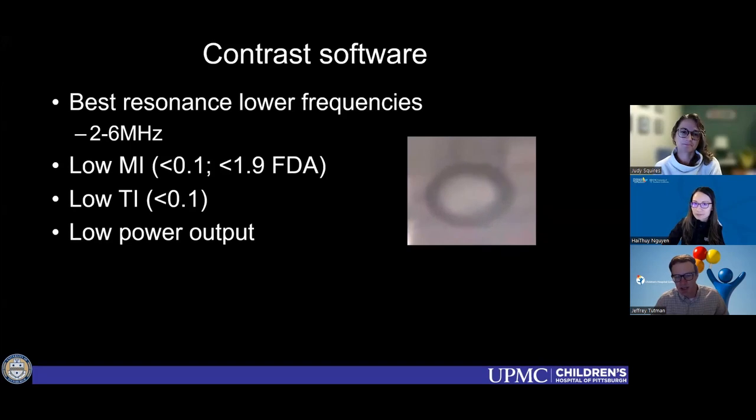I agree with you. Usually what I try to do is, if the lesion is in an amenable location, I'll try to do one injection with each probe just to get a different look at it, to see which one works better. Sometimes we'll try the curve and it doesn't look great, then I'll switch to the linear, because we always have the second injection.